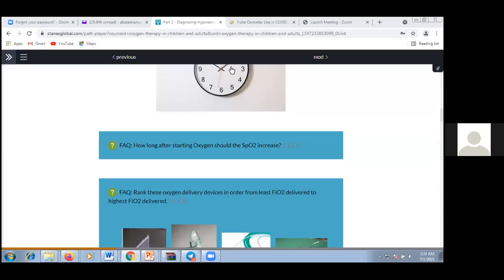One is within how many seconds can a pulse oximeter detect the result. The other is after oxygen reaches into the lung and then to the blood, where it can be detected at the periphery from the tissue.